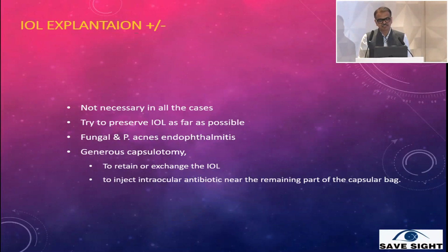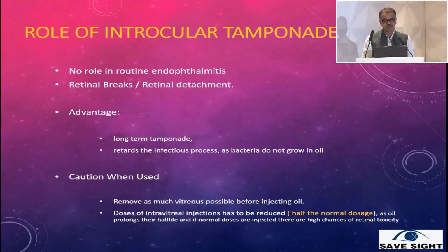IOL explantation is not necessary in all cases. We try to preserve the IOL as far as possible. However, in fungal and P. acnes endophthalmitis, these are the cases where you may have to remove the bag along with the IOL.